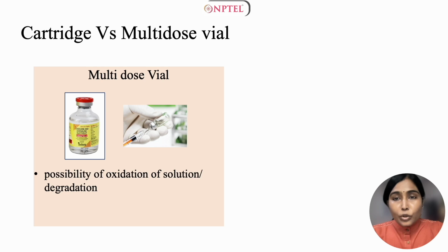Well, there is another problem too. Once open, we may not use up the whole bottle in a single day. So the solution is exposed to the exterior through the needle that we generally insert into the rubber lid for withdrawals. Now this can cause changes in the solution from degradation to oxidation and also change in pH of the solution. Now how is this important to us clinically? Such solutions can cause a burning sensation during injection. So the patient's comfort during injection is definitely compromised.